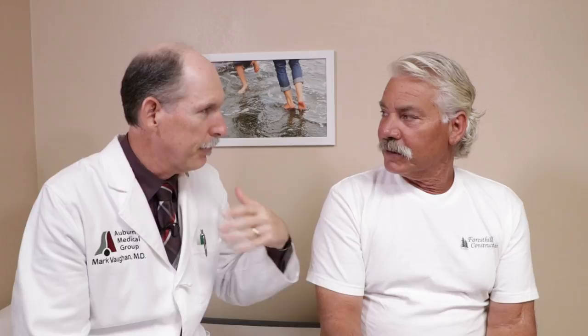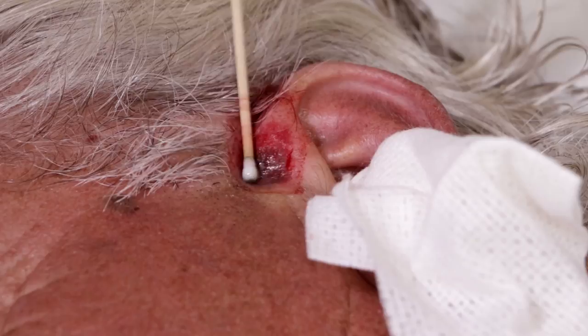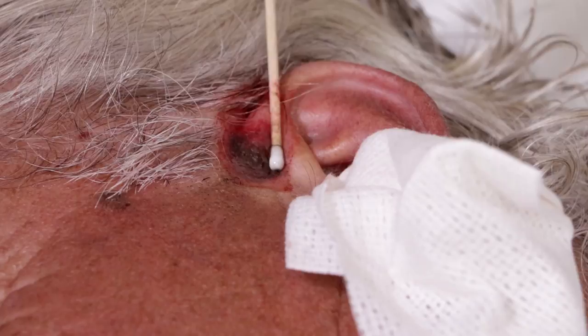Most surgeons use electrocautery — the little electric current device where you see a little arc and it smells like burning flesh. We don't use that here. We use chemical cautery with silver nitrate. We still have to keep an eye on it even after this treatment because it can come back, but this is a very effective, simple, relatively inexpensive treatment.